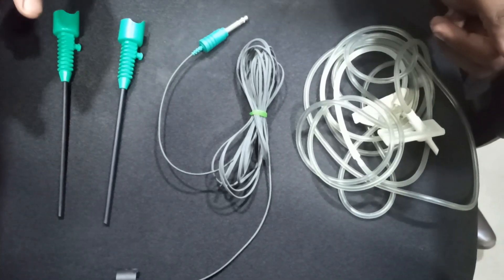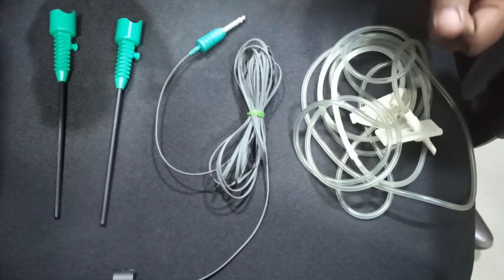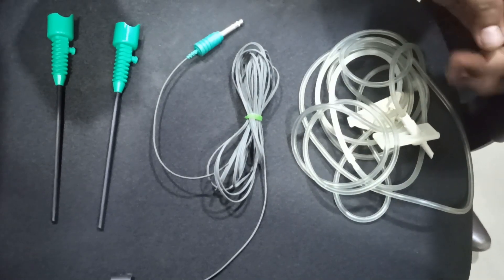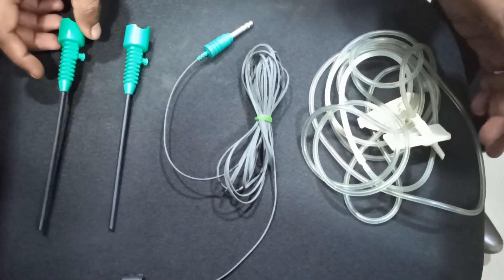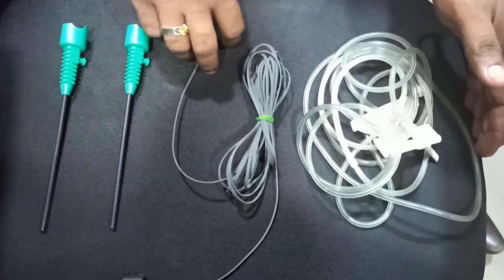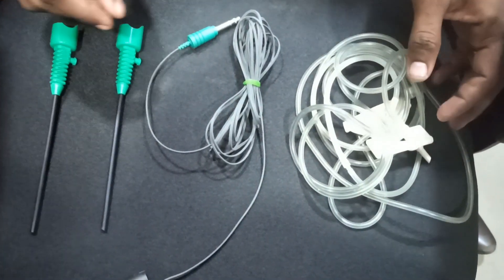Good evening friends. Now I'm going to demonstrate how to fix the endoscope sheath in the endoscope. This is the Medtronic Endoscope 2 sheath, which is used with the endoscope.